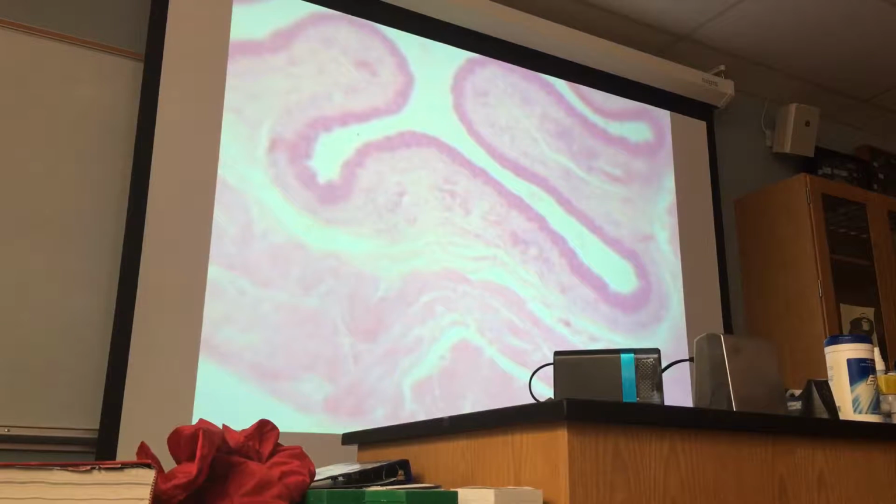If you look in the center, the screen is moving, and that is causing a problem. This is the lumen of the esophagus. While not eating, the esophagus is in a collapsed condition.